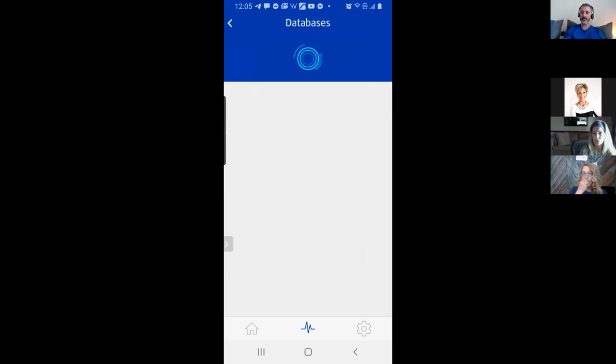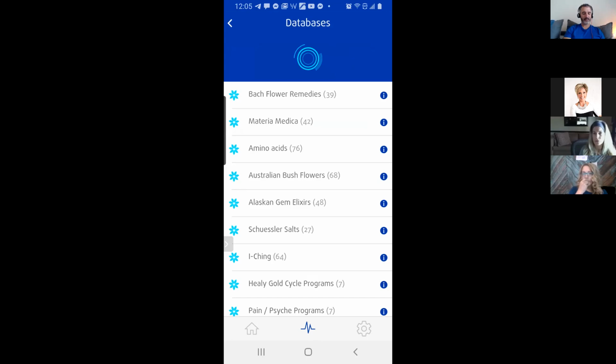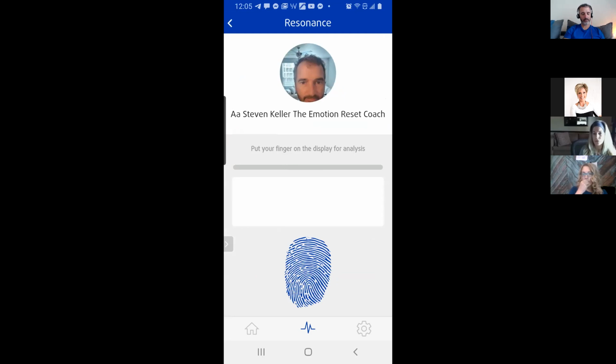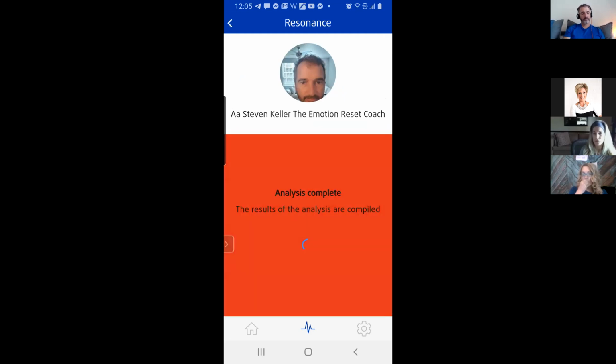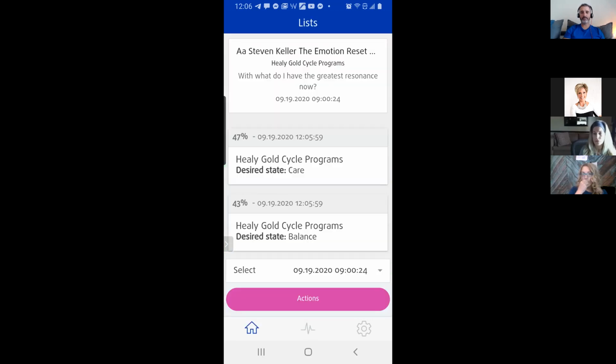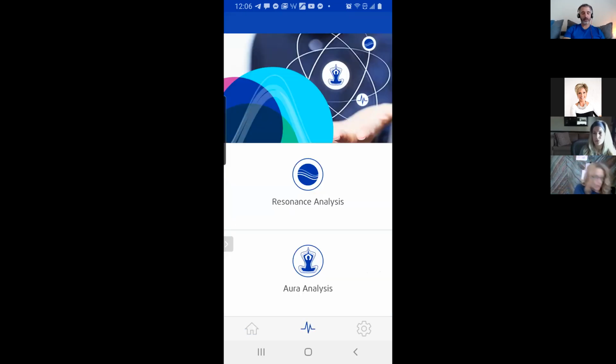Now you know why I keep my name at the very top, because it makes me incrementally slightly more efficient, right? So I go back to the gold programs and I go, okay. Boom. And it's going to tell me of all the gold programs, the one I need most right now is care. Right now, the fact that this only came up as 47% kind of gives you an indication of like, you know what, I'm doing pretty good right now. Okay. I can choose to run that specific gold program or do vibrational programs.